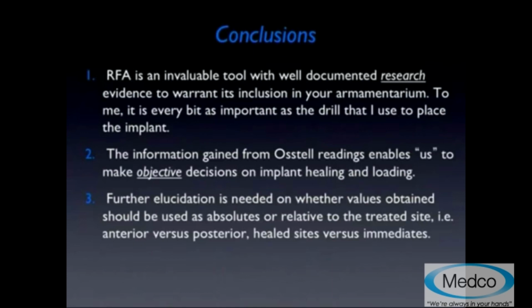And last but not least, further elucidation really needs to be made on whether values obtained should be used as absolutes or relative to the treated site. For example, is a 60 in the anterior maxilla the same as a 60 in the second molar area of the posterior mandible? Is it the same in a healed site versus a grafted site?